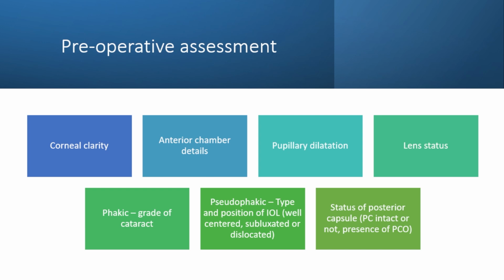But yes, in a few cases where you are sure about the pre-RD refractive status of the eye, like somebody says he's using the same glass power in both eyes, and they develop RD in one eye, you can always use the other eye refraction for the axial length or putting in the IOL, okay? Some clues to tell you so that you avoid one more surgery, basically, for that.